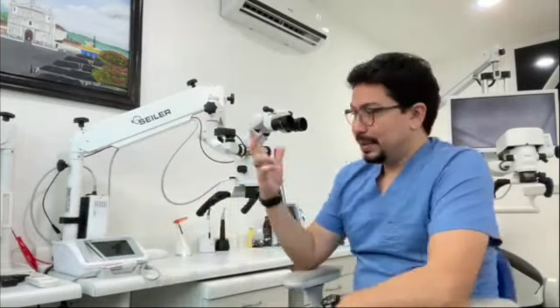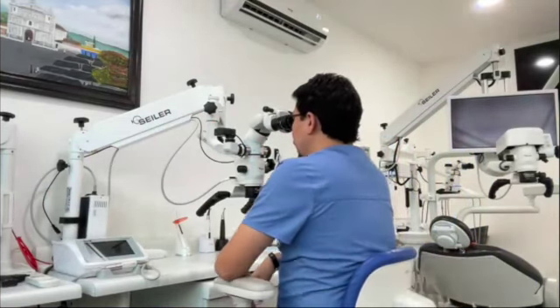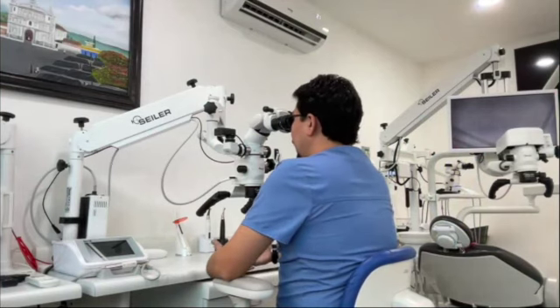But what happens when I work with the help of the regular microscope in this way? I lose my peripheral vision. At least at the very beginning of the learning curve, I am going to lose my peripheral vision. And if you don't have that peripheral vision, you are not going to know where your hands are located.